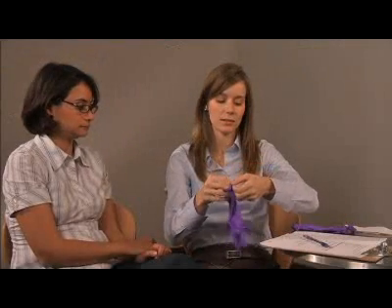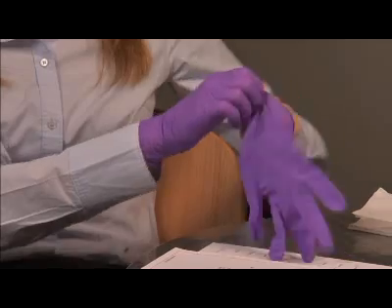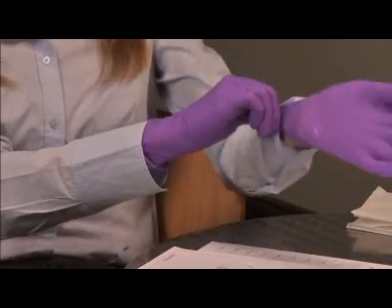Wearing gloves is both for you, the field worker, and the participant. It will help prevent any possible contamination with the salivette, but also minimizes any contact with the participant's saliva.